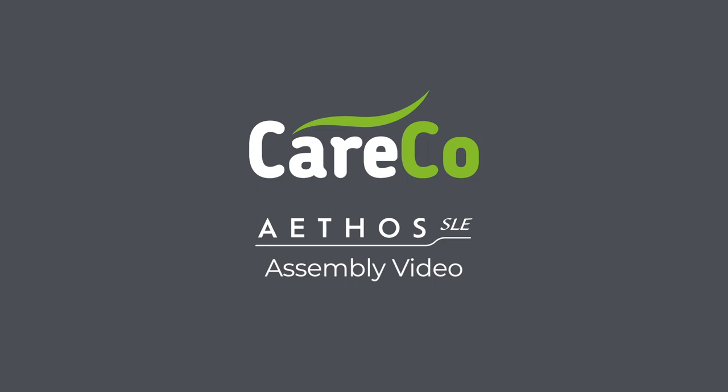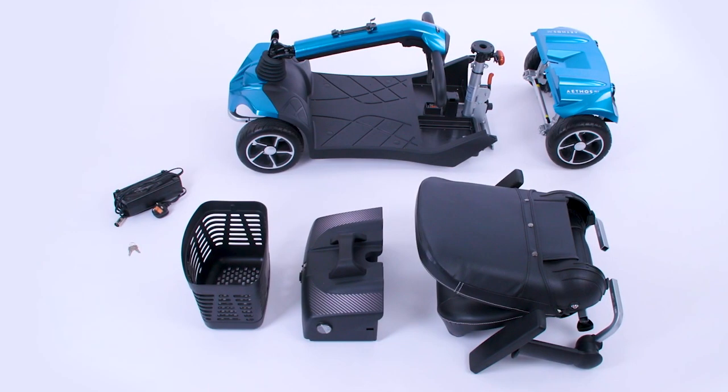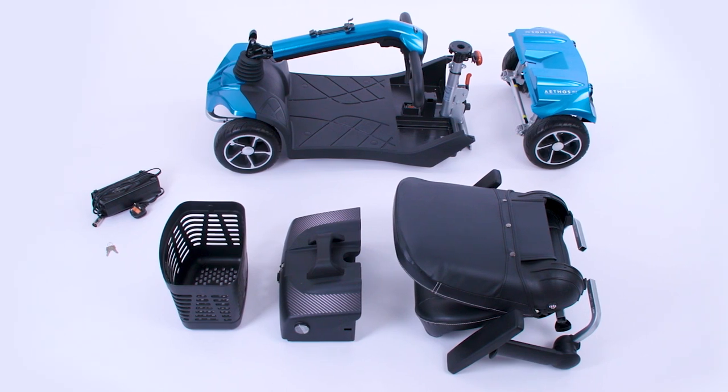Careco Athos SLE assembly video. Start with all the items laid out in front of you.